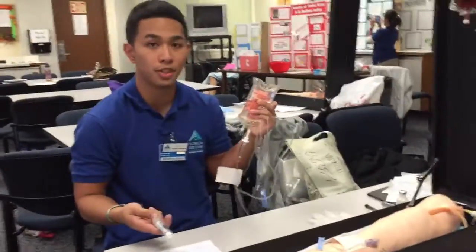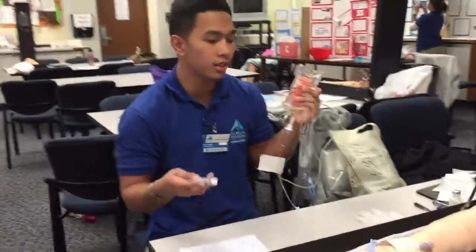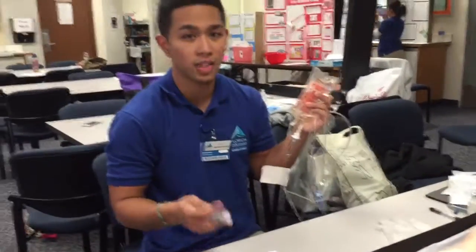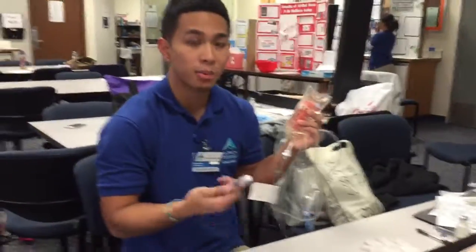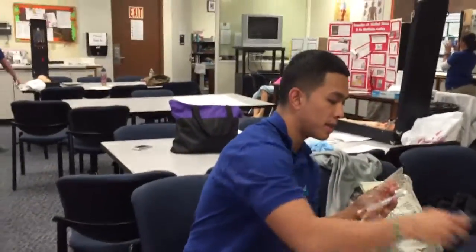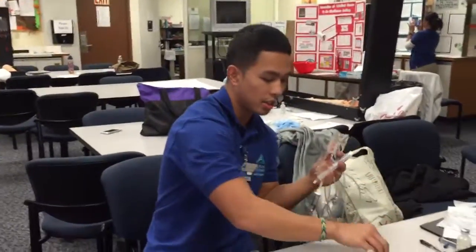And then you would also normally draw up 6 milliliters of normal saline in order to perform your ASASH, which is aspirate, saline, administer the medication, saline again, and heparin. You can only use the heparin if it's a PICC line or if the doctor orders it. But for this purpose, we have a pre-filled syringe of saline right here, so we can go ahead and use that to save a little bit of time. So I'm going to go ahead and gather all my supplies right here. Got that. Take my doctor's order to the MAR. We're going to go ahead and go into the patient's room.